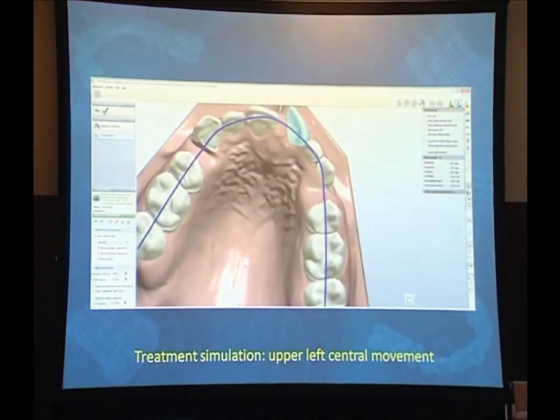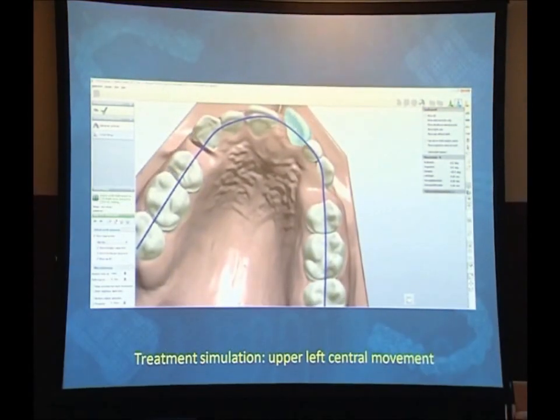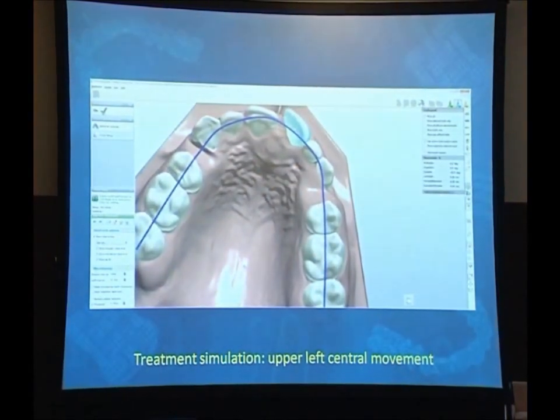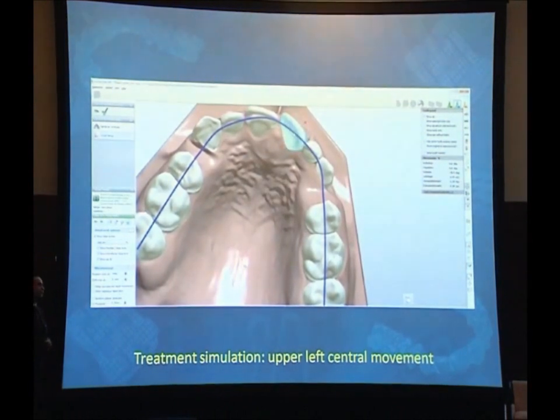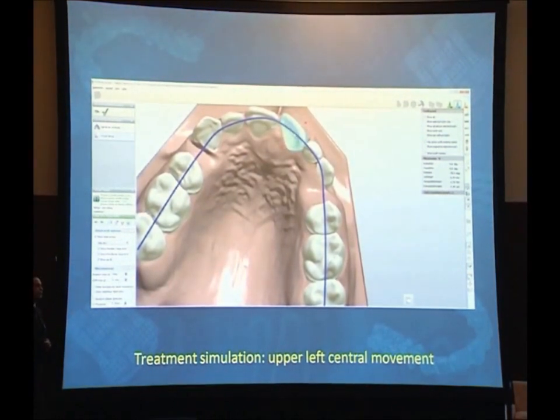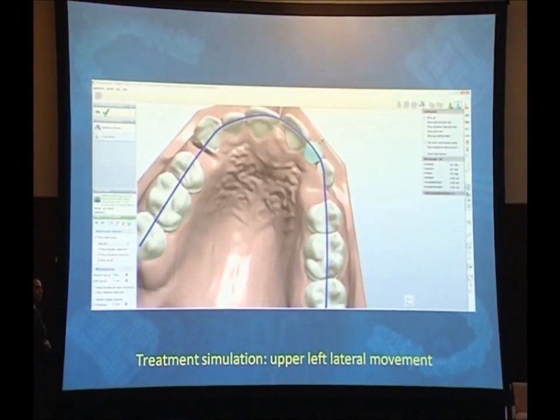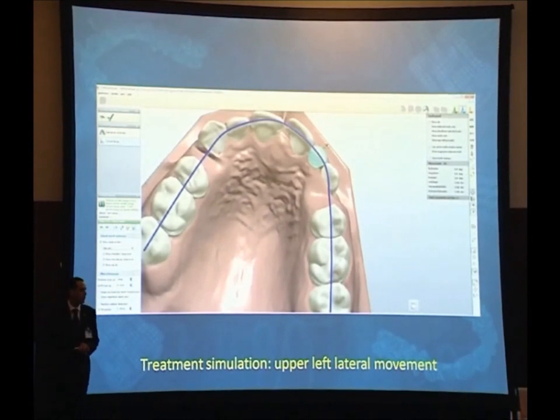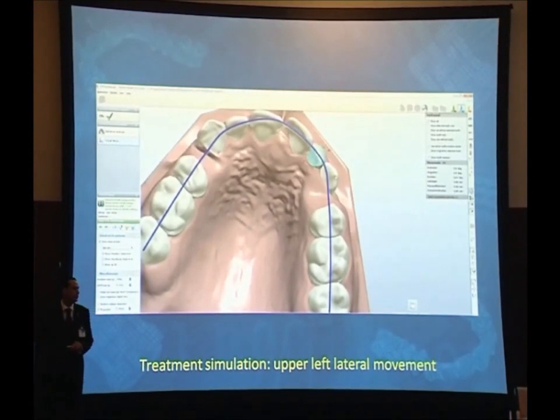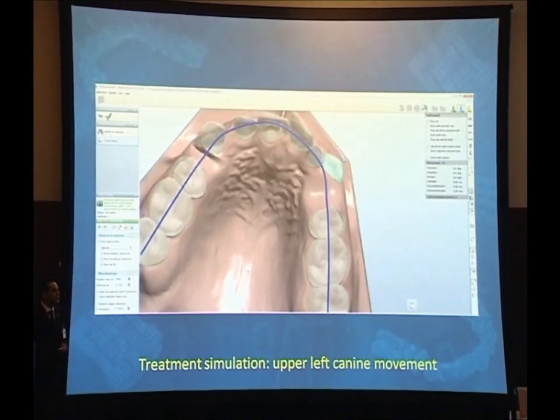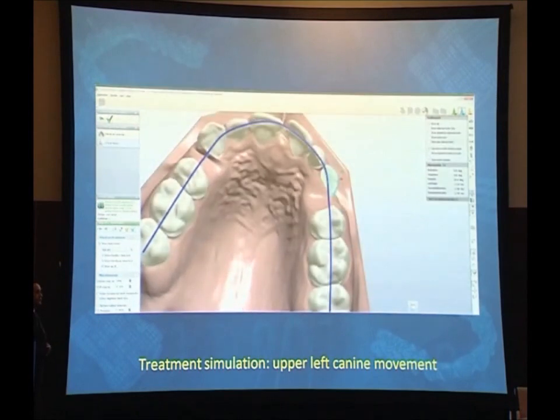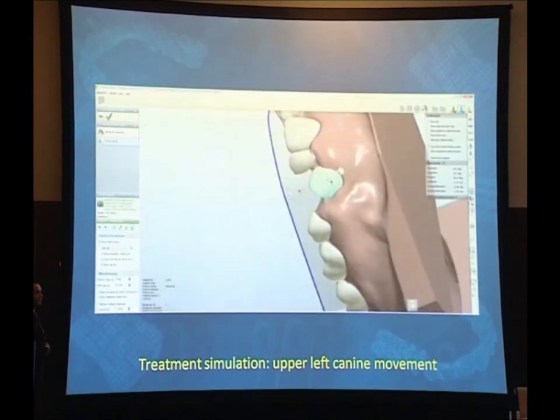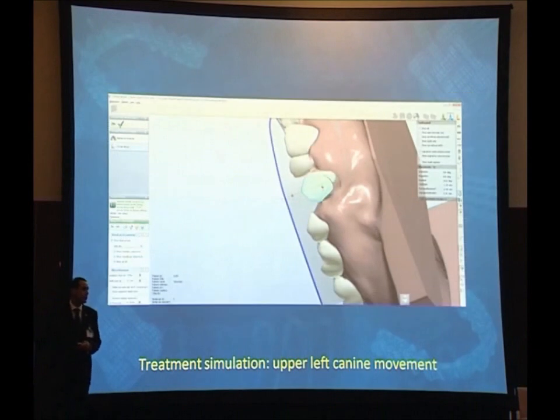The other central will be rotated, then we'll push palatally. Rotation for the lateral, and finally we will move this canine more distally. We will need to make more extrusion.